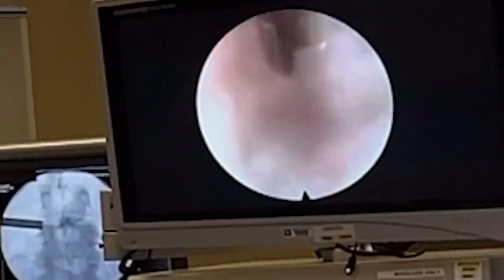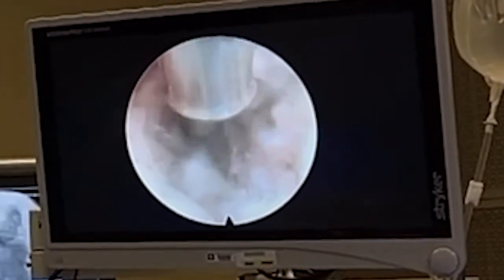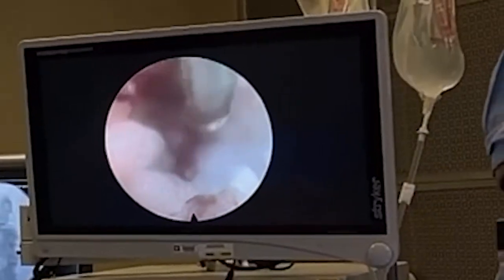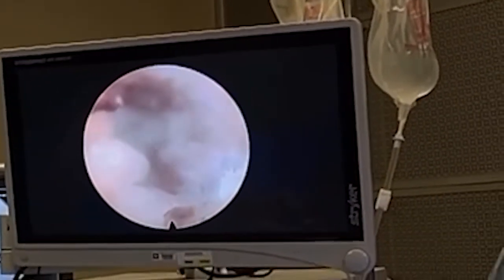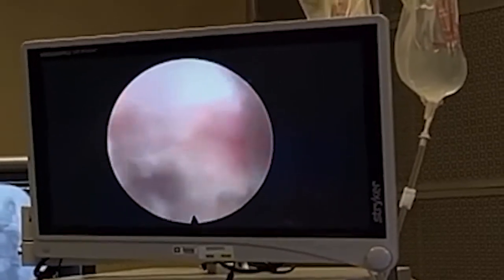In the famous words of George Bush Sr., a thousand points of light. I don't know if you saw the annular tear from inside. I was going on and on about it. The nerve is free. I can get into the canal.